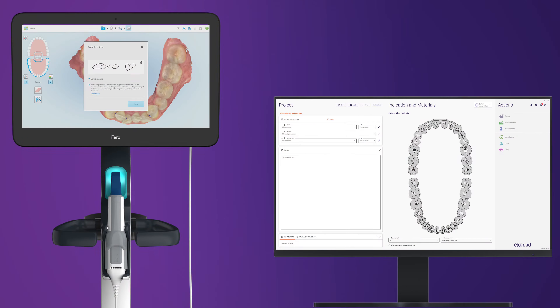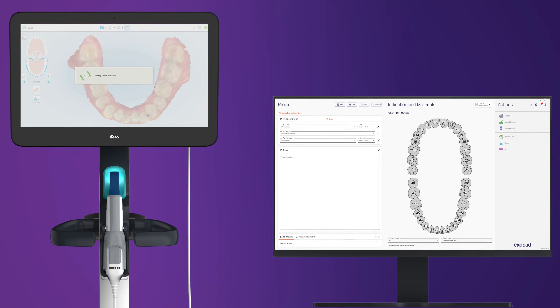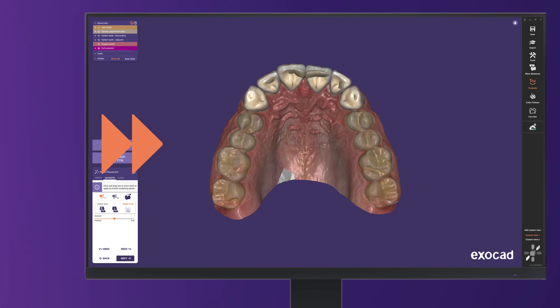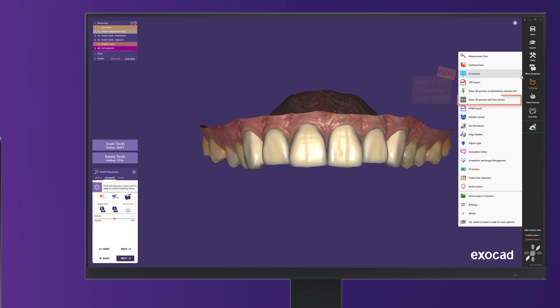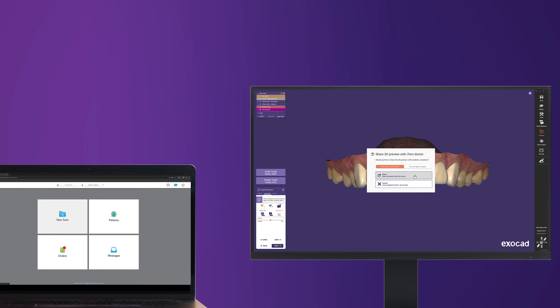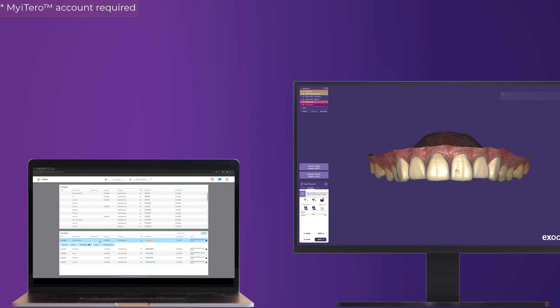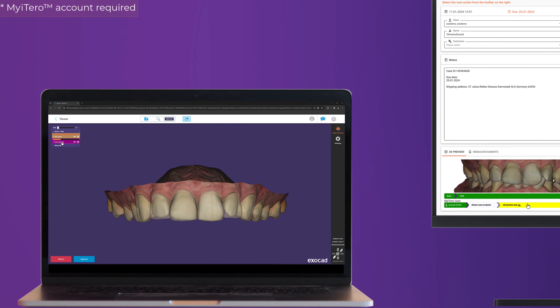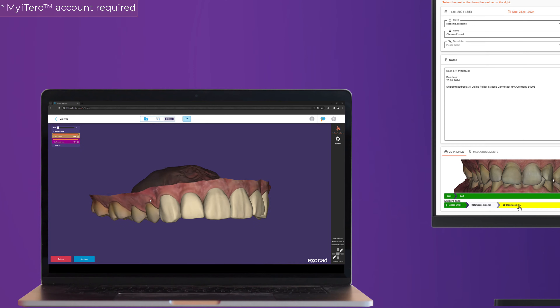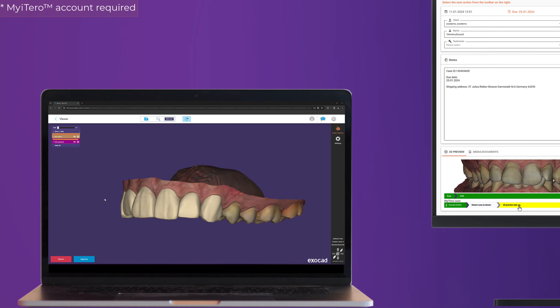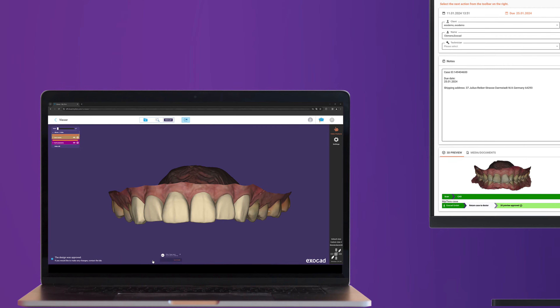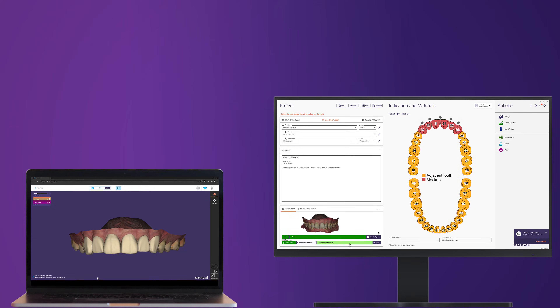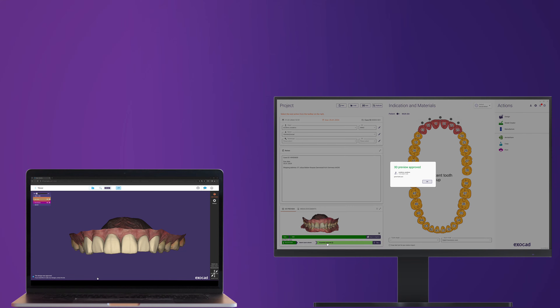With the new iTero Exocad connector, you bring your lab-doctor collaboration to another level. If activated, the CAD user has the option to share a 3D design preview in any design step directly with the doctor. Doctors can accept or reject designs, avoiding unnecessary remakes. This bidirectional case communication marks a milestone in lab-doctor communication.